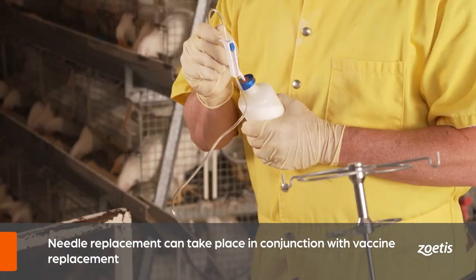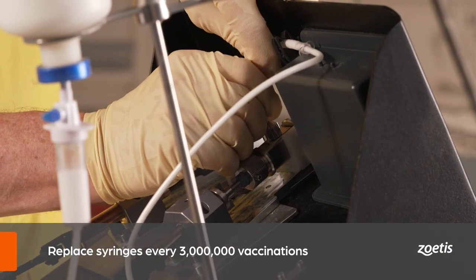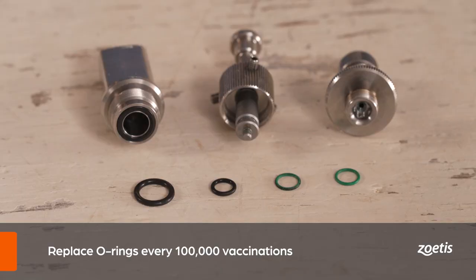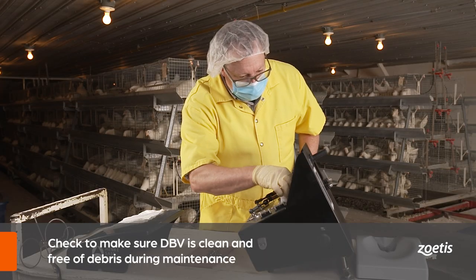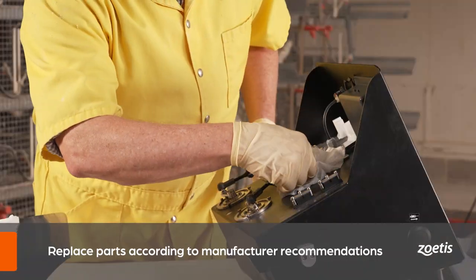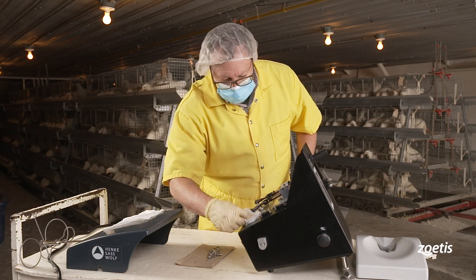Timing the replacement of the needle with the vaccine is a good way of remembering to replace it periodically, and also adds efficiency by limiting downtime. Replace the syringe every three million vaccinations. Replace O-rings every 100,000 vaccinations. Replace the drip tube after each vaccination day. When replacing parts, make sure the device is clean and free of obvious debris, and replace parts according to manufacturer-recommended guidelines. If additional maintenance is required, refer to the manual for specific instructions.